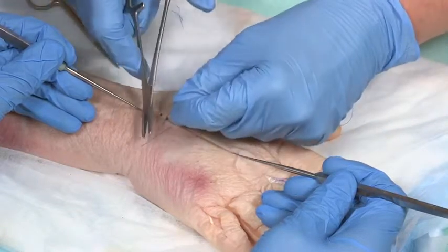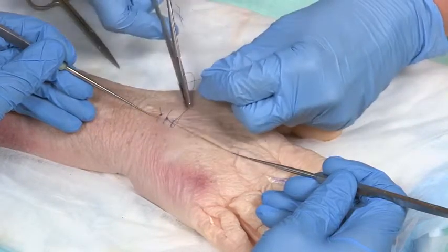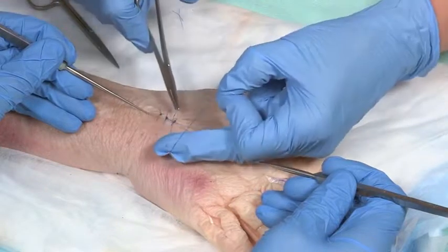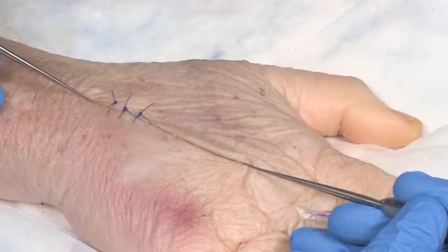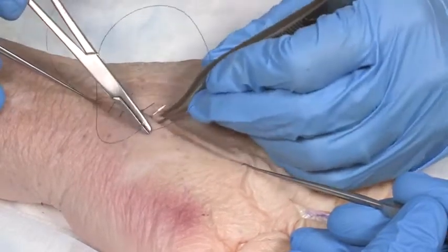Cut the suture material to such a length that it can be grasped for the purposes of removal, but not so long that the edges get caught in the wound. If the suture edges are cut too short, they're more likely to unravel. Lay the suture knot to one side of the wound.